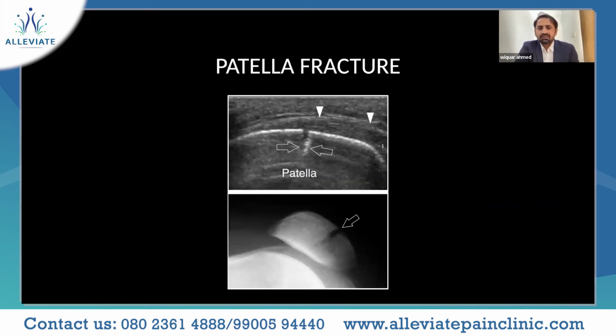This is a case of persistent anterior knee pain. So when you have visualized the cortical defect, you can see a very nice cortical defect. Again, this becomes a red flag for us. A patellar fracture which is present there.